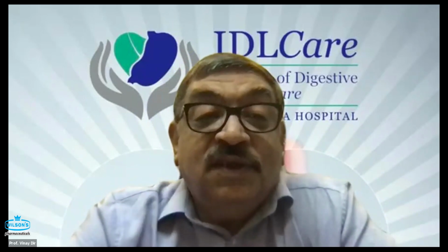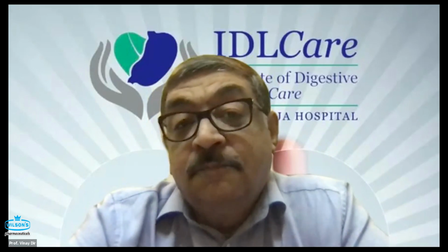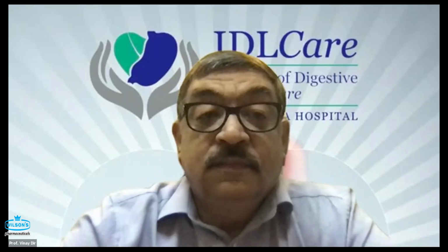So that was the first question. The second question is again a great question. You are going through the papilla, so pancreatitis will happen. In our study with Professor Takao Itoi, of more than 190 patients, the incidence of pancreatitis was 2.5%. It does happen. So it's roughly the same as in ERCP.